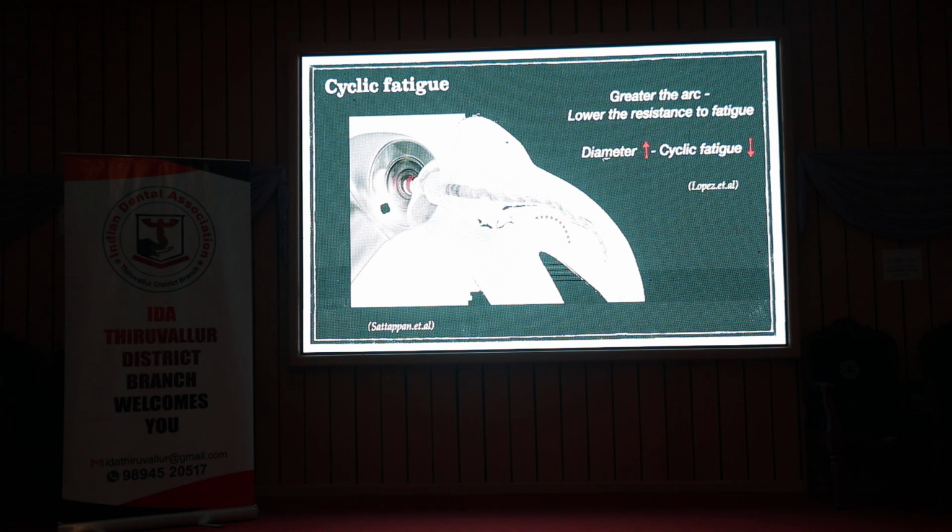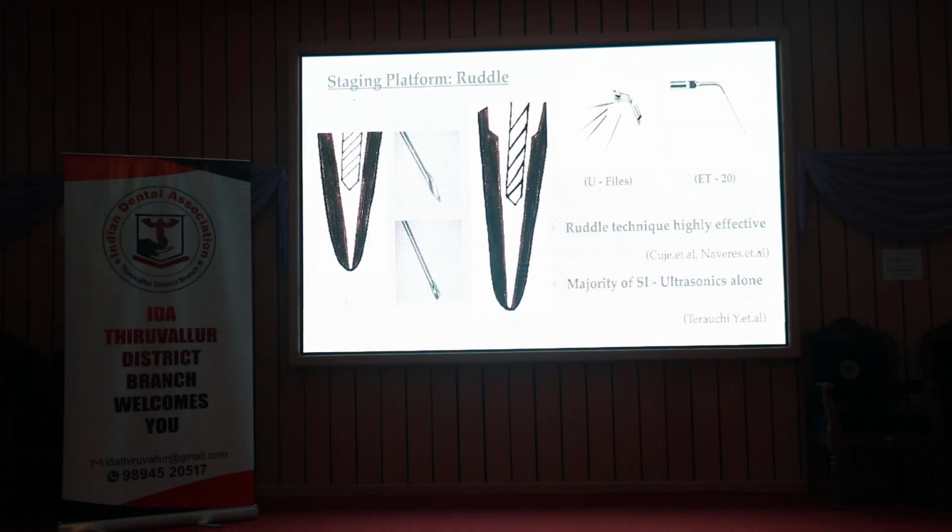Okay, and then the other fatigue is this one. In a curved canal, inside of the file there is compression, and outside there is stretching, or tension. Because of repeated stresses inside and outside, the instrument breaks. These are the two reasons, or some researchers feel both cyclic fatigue and torsional fatigue combined together can also occur. Outside there is stretching, and on the inside there is more compression, and repeated stressing like this leads to a failure.